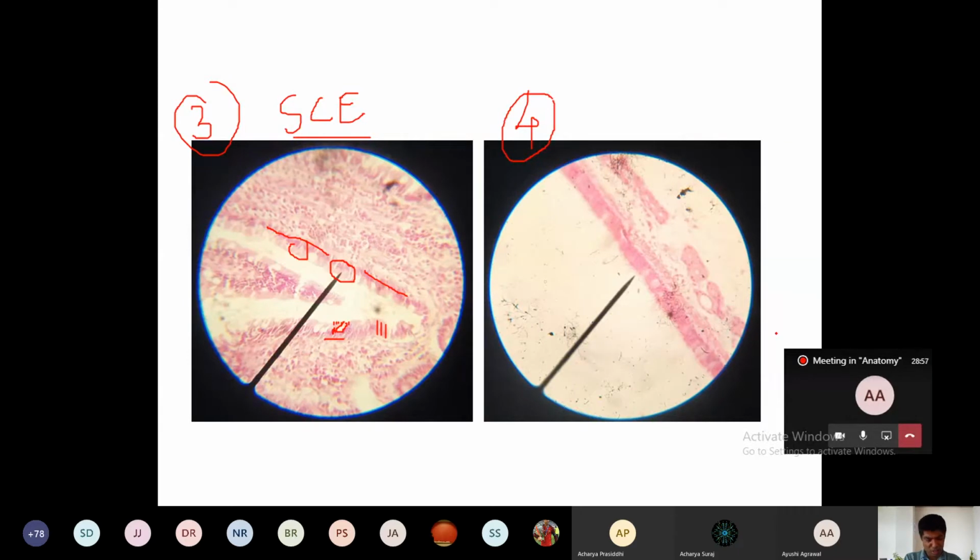It is the epithelium of the respiratory system. Do not forget it. It lines the trachea. It lines some part of the larynx, even part of the epiglottis. Not all, but some part. You learn this properly. Everything I cannot detail now. And then it is also lining some part of the male reproductive system, like epididymis, and what's the other one? Vas deferens also, isn't it? So distribution you have to learn.